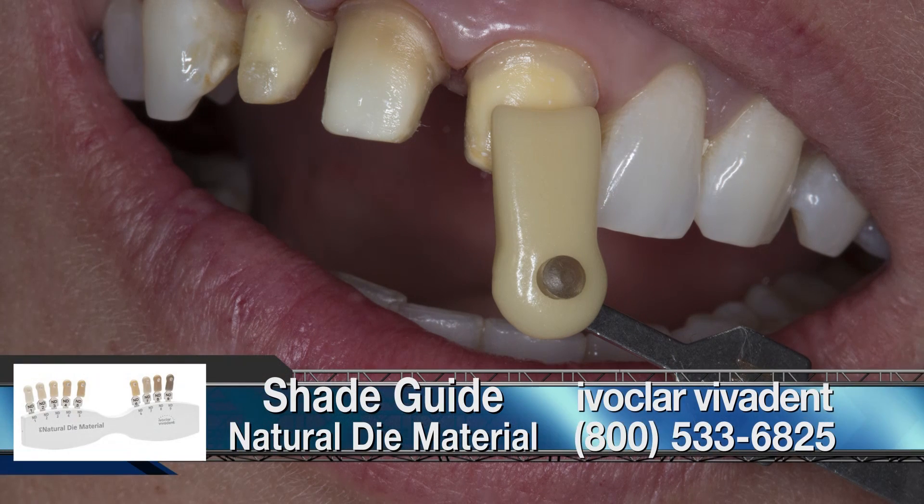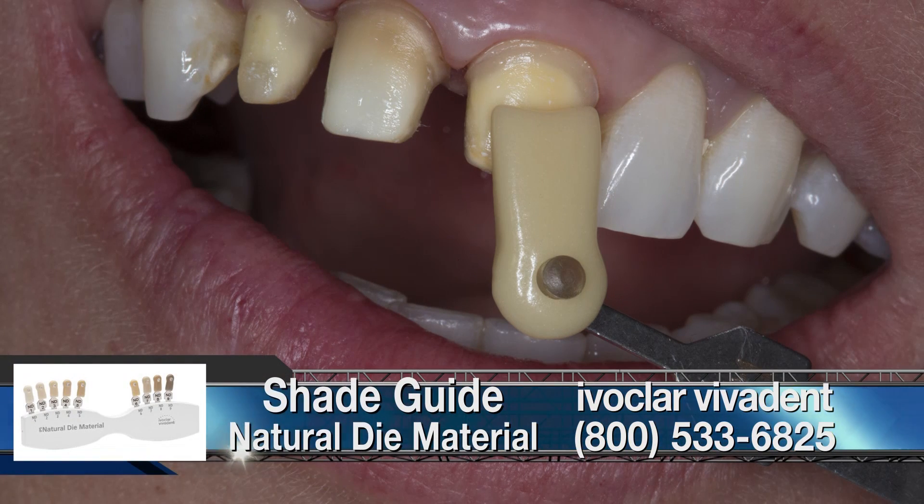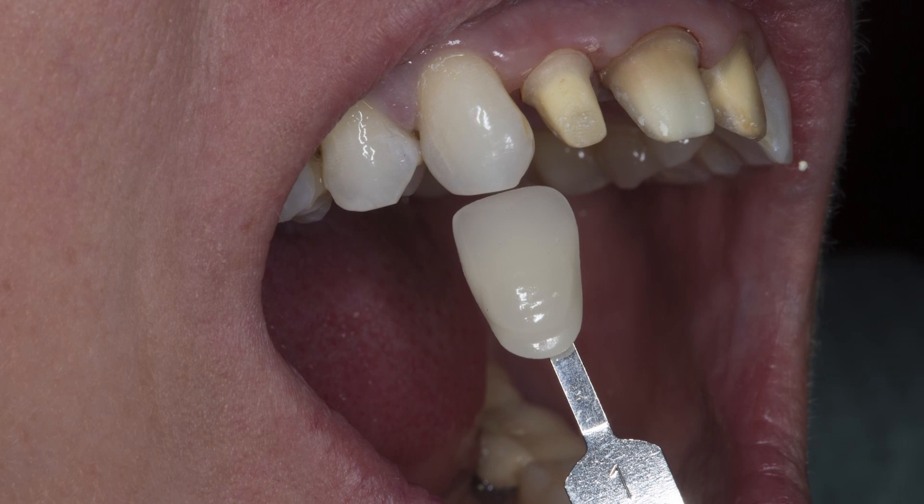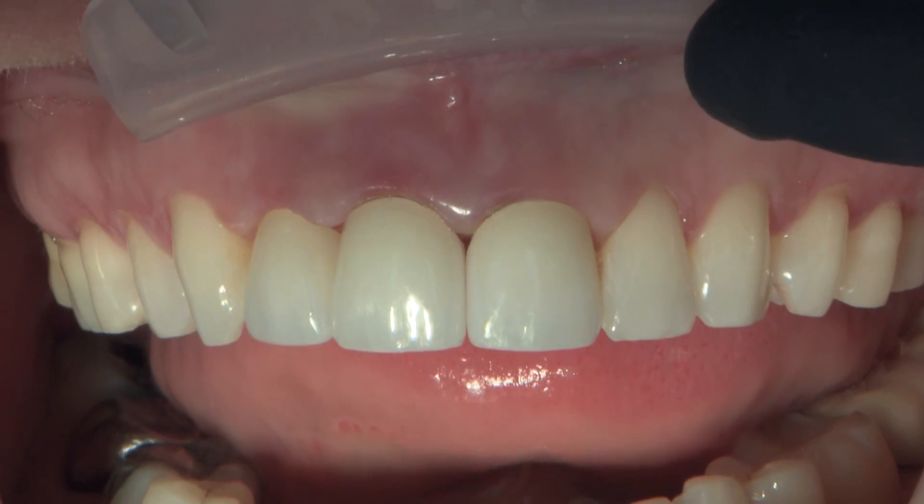There's the ST1 from the stump shade guide — the natural dye material shade guide from Ivoclar. And there's a 1M1 shade tab being held to the adjacent cuspid. This patient has also done some vital bleaching; otherwise you'd never see a 1M1 cuspid.